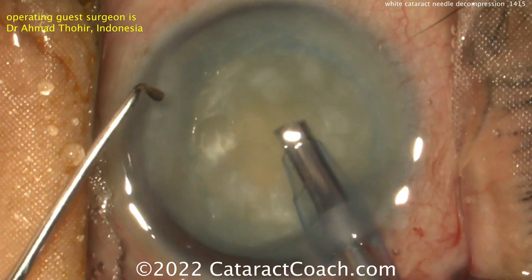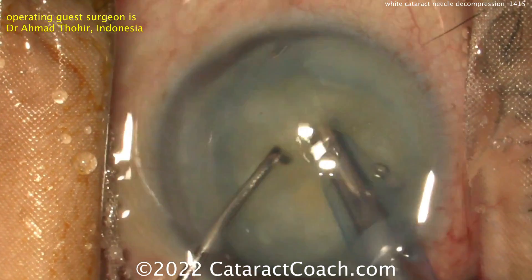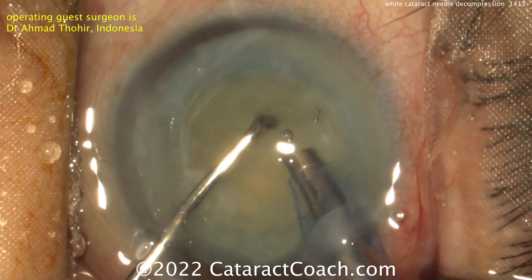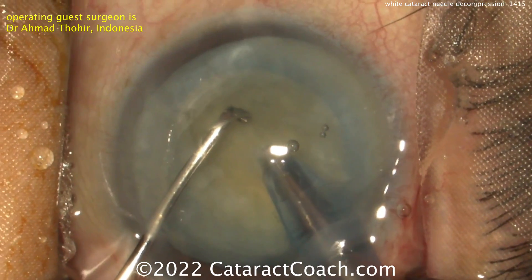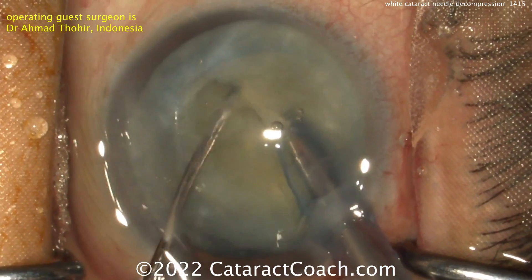Here comes a phaco probe and a chopper. Probably a horizontal chop. Cleaning up some of the anterior lens material. The phaco probe goes into the nucleus — bury the phaco probe. Chop around the equator. It looks like a pretty good horizontal chop.